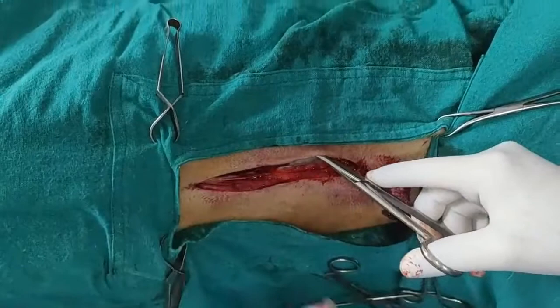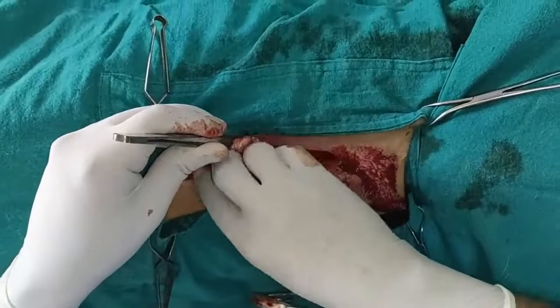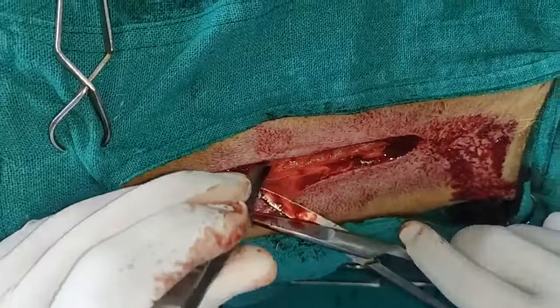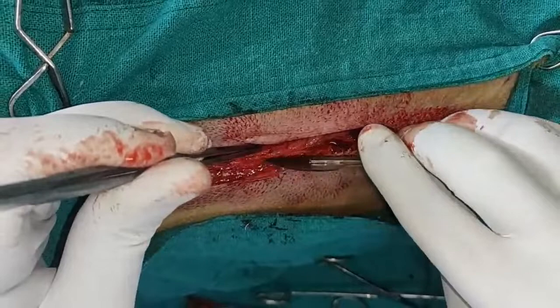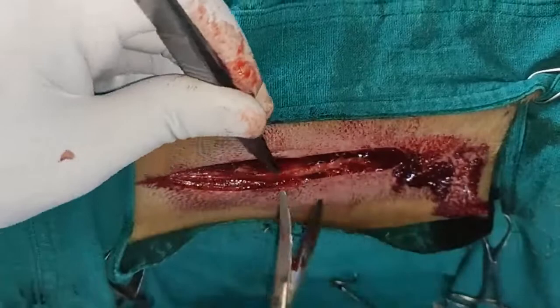You can see here the peritoneum is still intact. Peritoneum, you can see here. We have cut the rectus abdominis muscles. So peritoneum is here. So I just lift a little bit here. And fatty, in large breed animals, sometimes it happens. But you should know the anatomy. Sometimes it is separated, sometimes it is cut in a single layer.